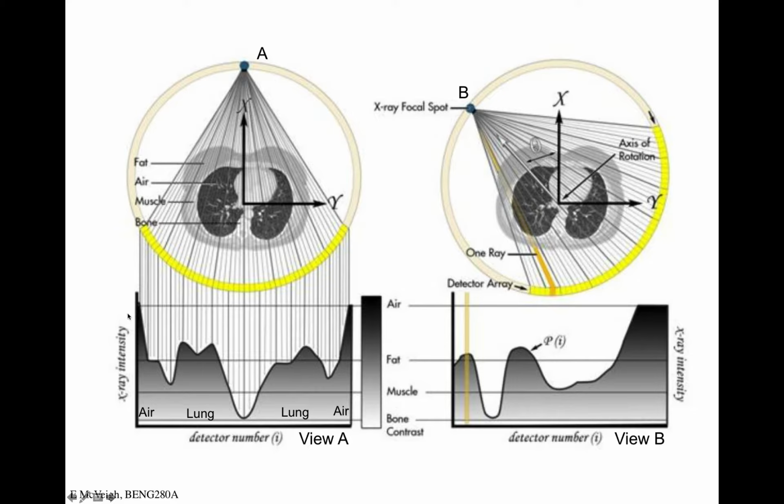If we could measure just the signal coming out here, if it's linearly proportional to X-ray intensity, then if my source is up here and I pass through the patient, say from the anterior to posterior side, and I hit their sternum, or I could hit their spine, I have two possibilities of hitting bone on the way through.